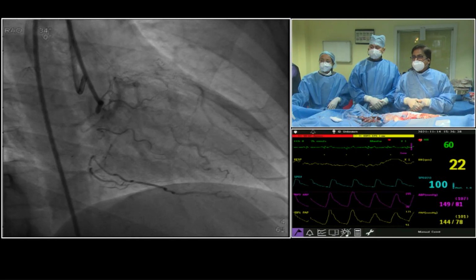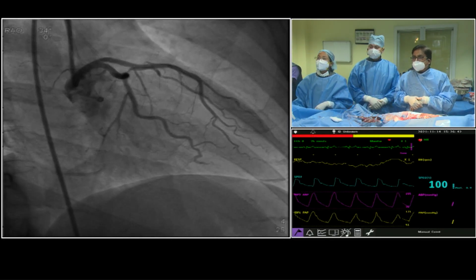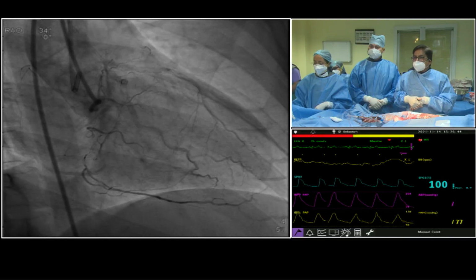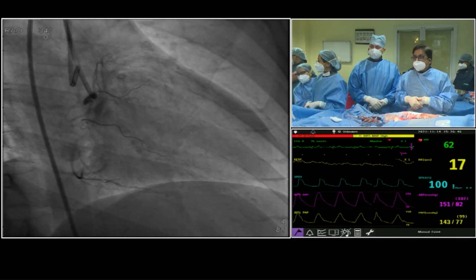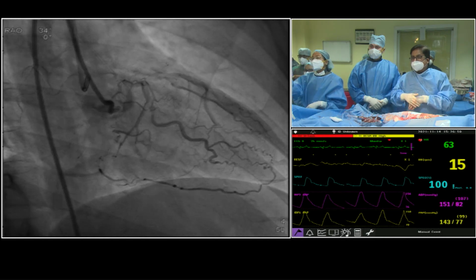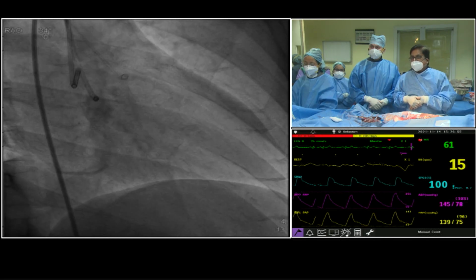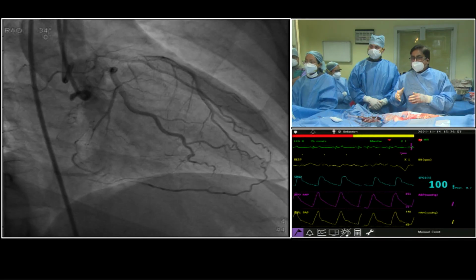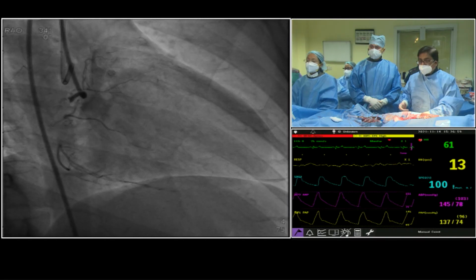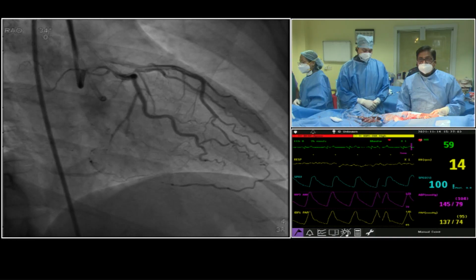And then there is some small shorter connection from the distal LAD across the so-called septal, but these also become subepicardial when they are very distal. So they do not remain in the septum anymore. That's what the teaching is. So anyhow, we have to give an antegrade try and see what happens. Okay? So I will try for the antegrade first.